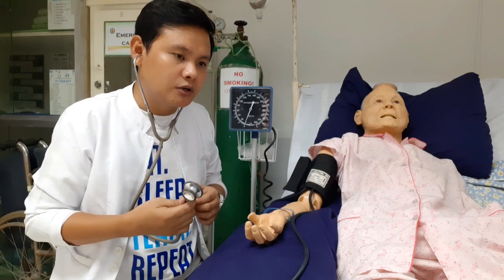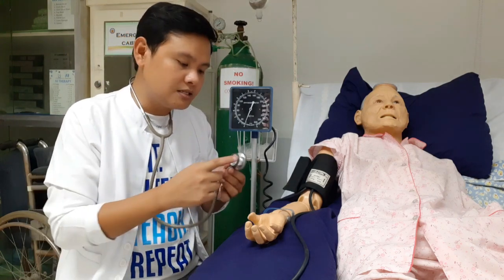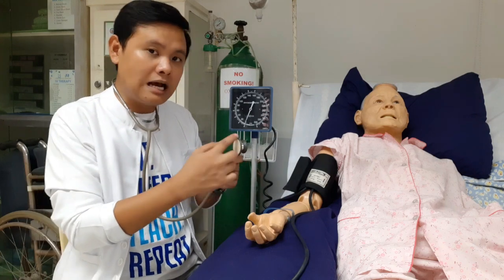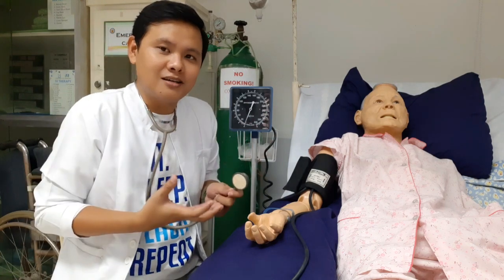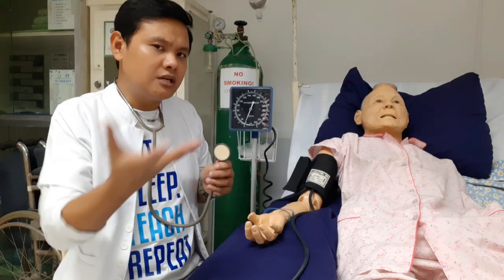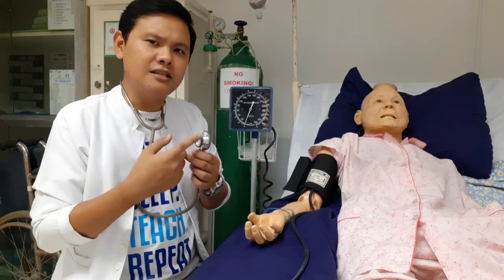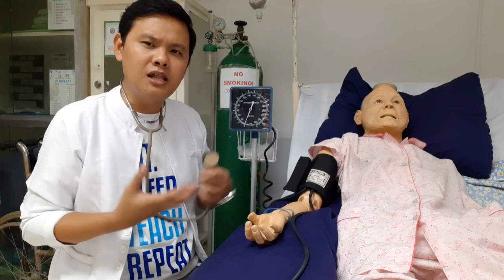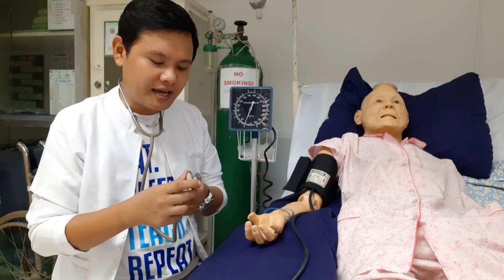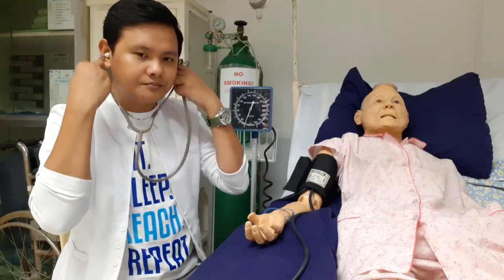As I mentioned to you before, in this procedure, BP taking as per Kozier, what we supposedly use is the bell. But there's also a rationale: if you look at hospitals, they also use the diaphragm. Most of the time, the nurses, even the doctors, use the diaphragm. So there's also a rationale behind that. Check which one is really better to use, the bell or the diaphragm. Either of the two is acceptable, but again, we will follow what is in our book, which is Kozier's. So once again, I check which one is open, the bell or the diaphragm.